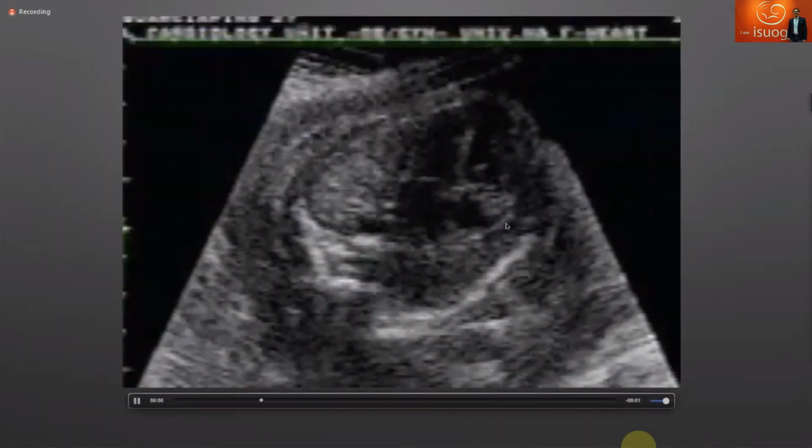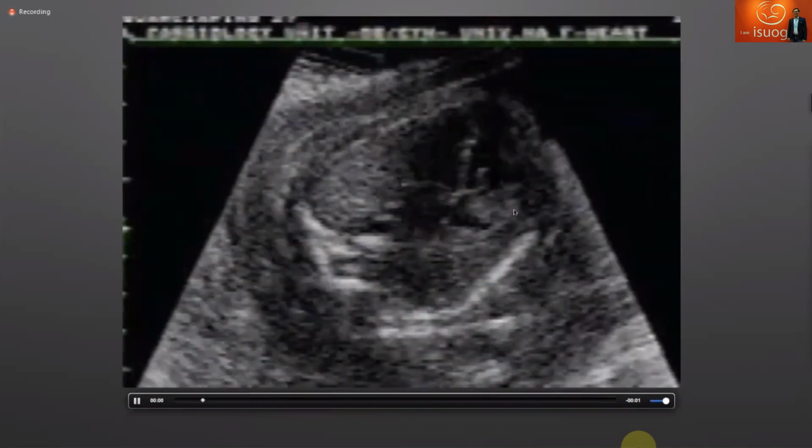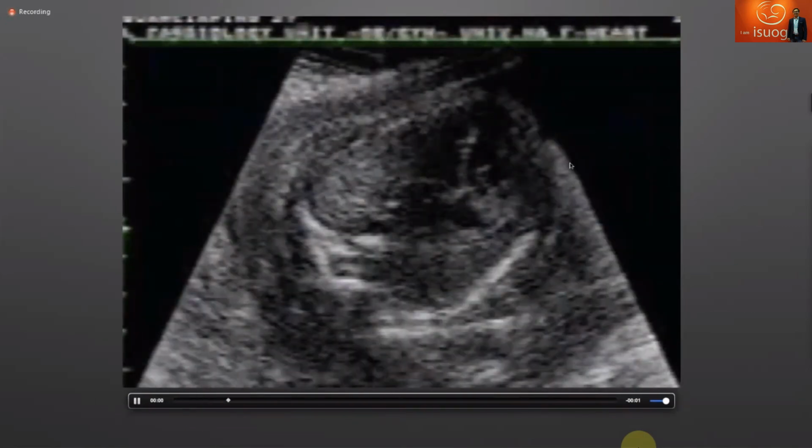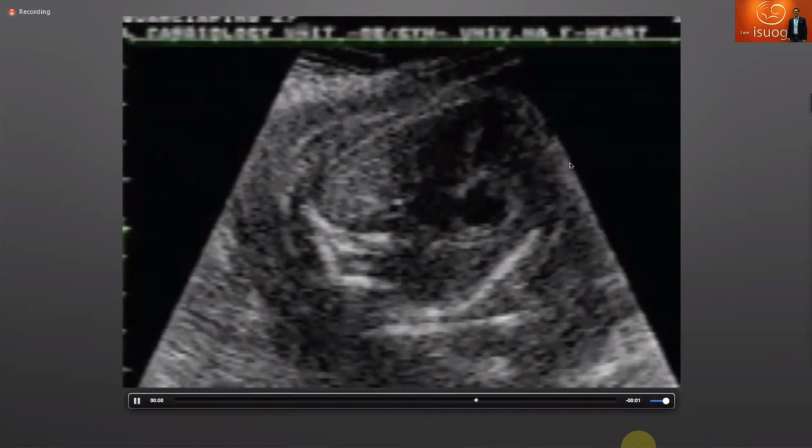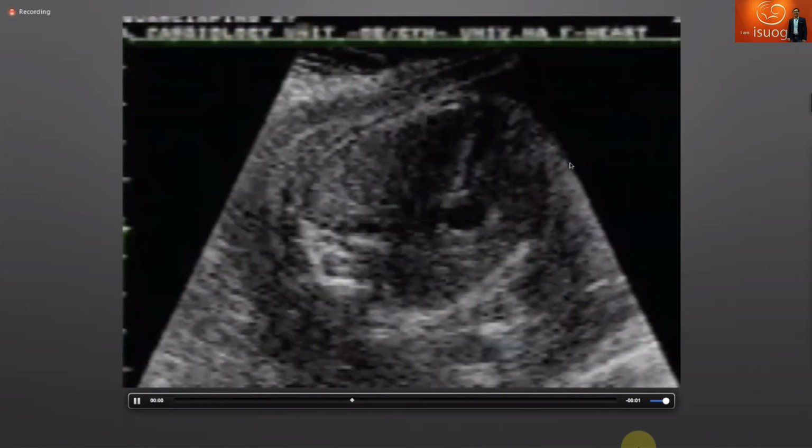He sent me the video of his case of 2002. It was exactly the same. So having knowledge, having written, having read many things in the literature, we came to the diagnosis.